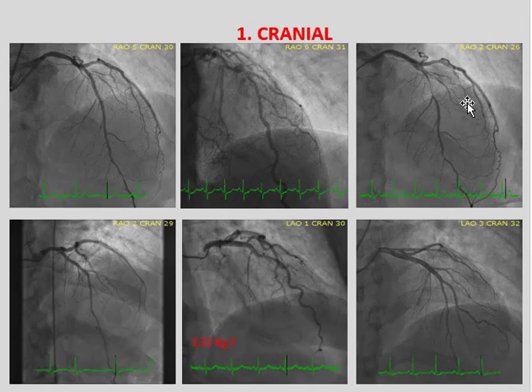Have a look at this one. In my ECG tutes, I mentioned the anteroseptal changes that are associated with ischemia and infarction. Look at this vessel. This LAD is almost occluded. That patient would have ST changes in his septal branches and his anterior branches, because if that vessel occludes, you're occluding all those septal perforators along with the main feeder artery to the anterior wall. So that's why infarcts are so common in the anteroseptal aspect.